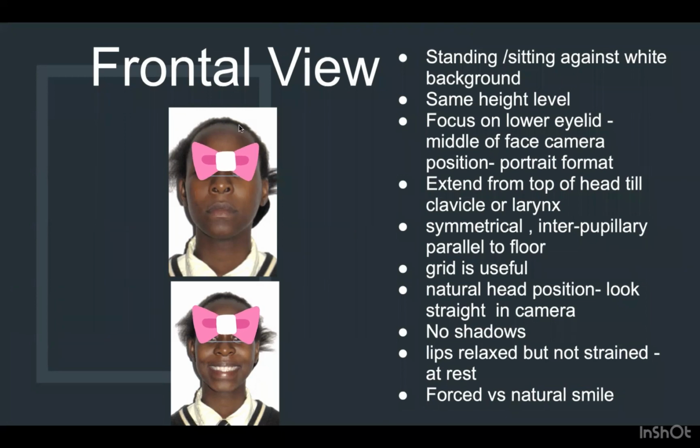And it's always in a portrait format, not in the horizontal, okay? So keep it in the portrait format. Don't think that you can make a landscape and you can change it. It will not come correctly. When there is a landscape needed, you do the landscape. When the portrait is needed, take a picture in the portrait. Extend from the top of the head till the clavicle or the larynx.